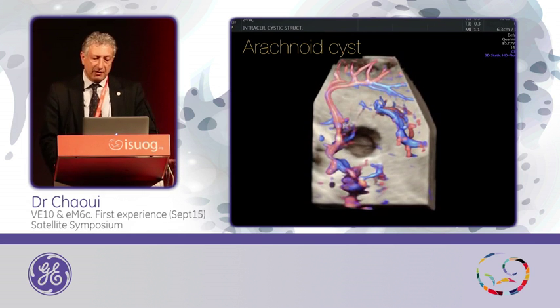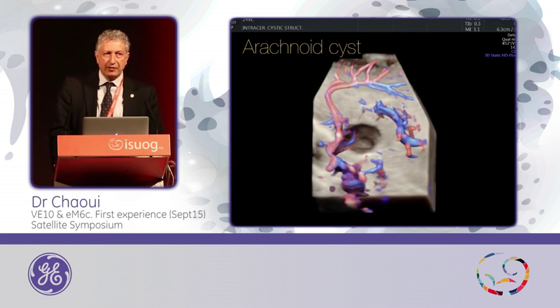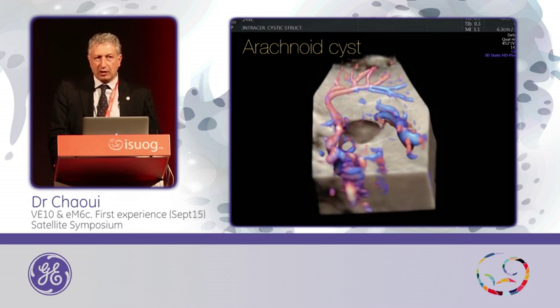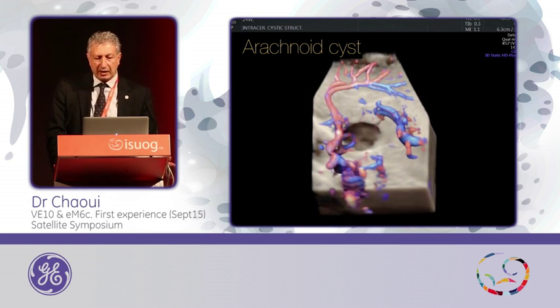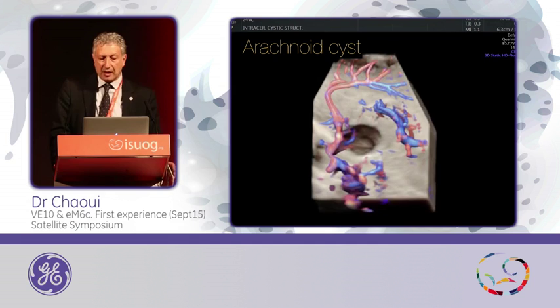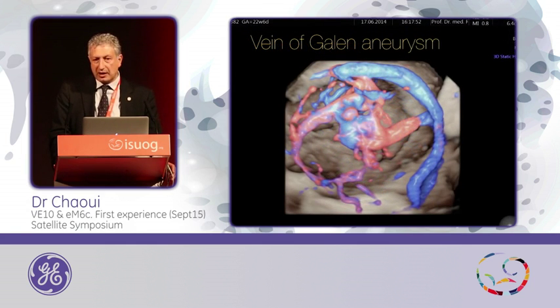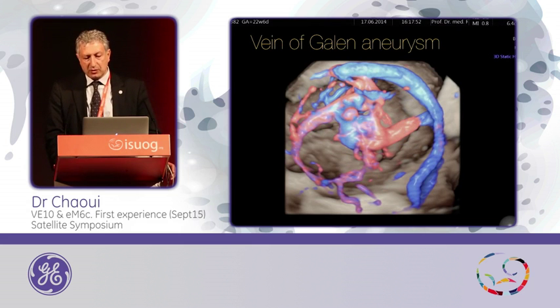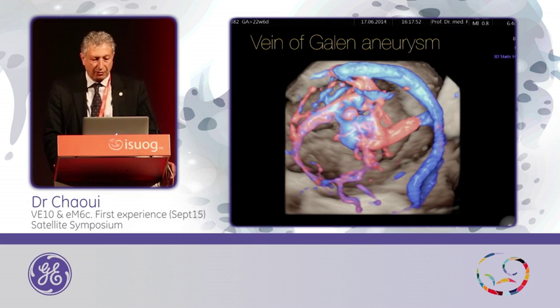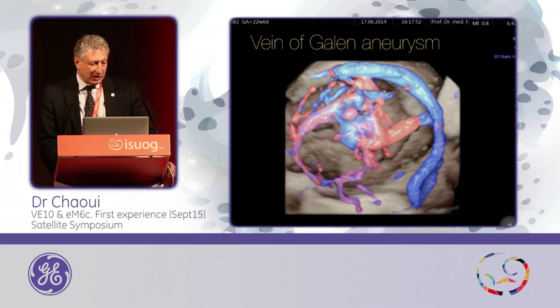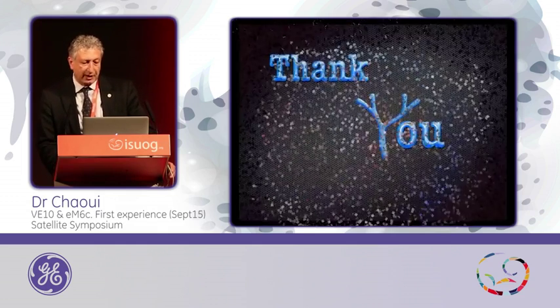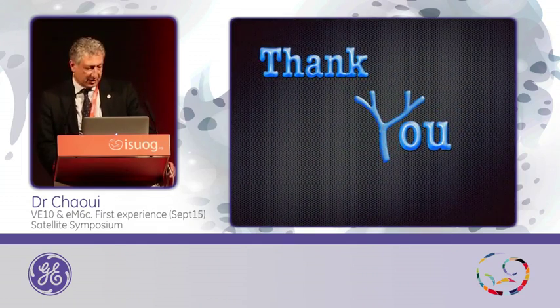In the other case, if there was a true vein of Galen aneurysm, you will have seen a lot of colors in the brain. This is another example seen in June at 22 weeks, where you see the large dilation of the vessels and the large vessels within the brain, with this cystic structure of a vein of Galen aneurysm. I would like to thank you for your attention and hope to make you curious to use this machine. Thank you.